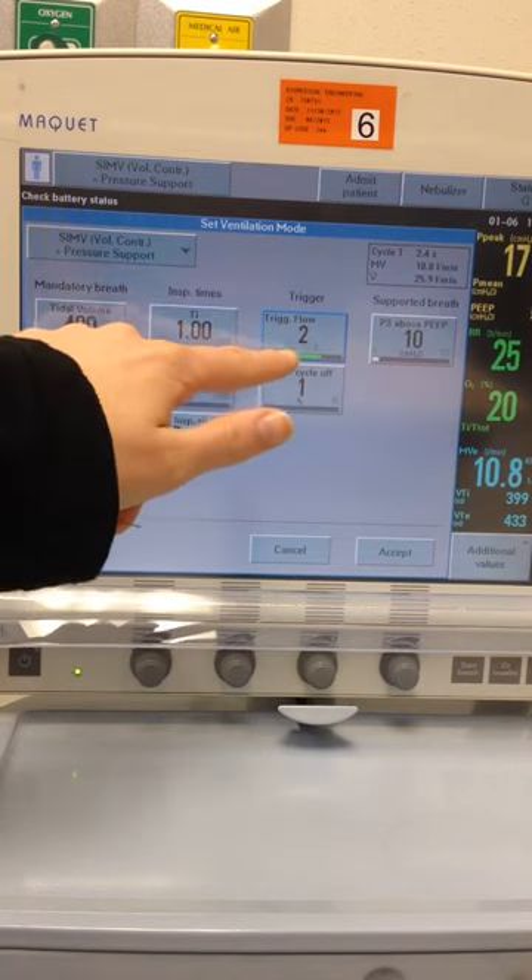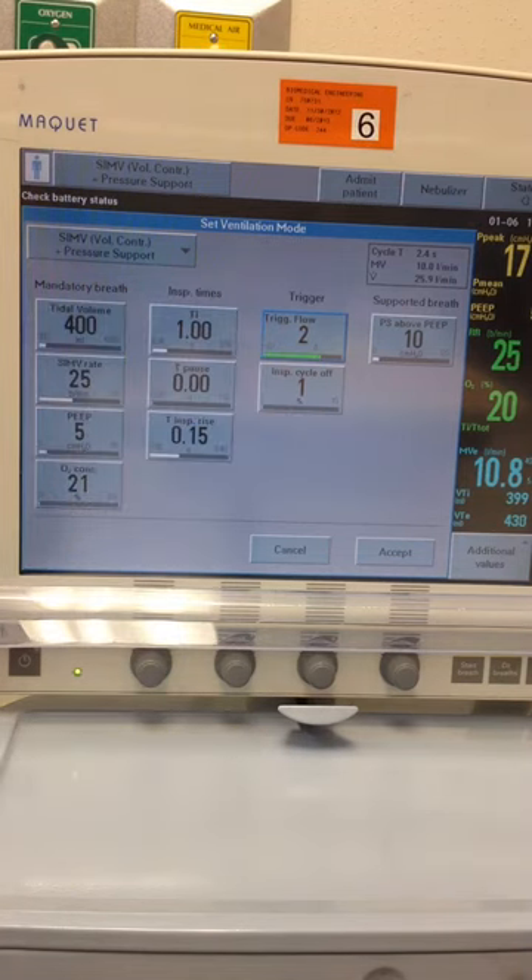We can adjust our flow trigger once we get it on our patient, so we make sure it's sensitive enough without auto-triggering. And we want our inspiratory cycle off all the way at 1%, because we want to ensure we get our full inspiration.